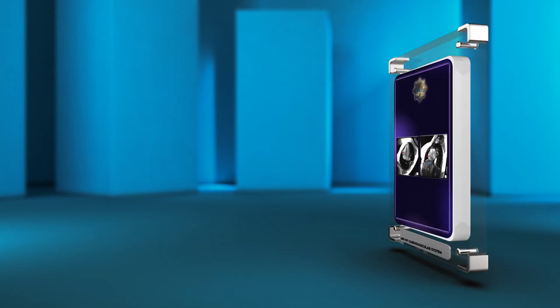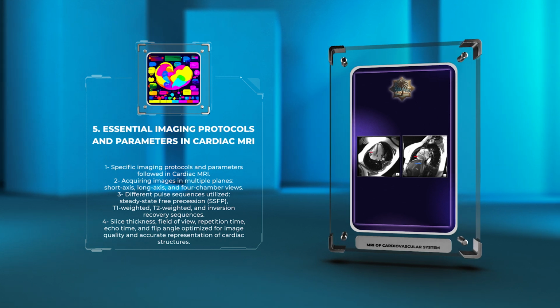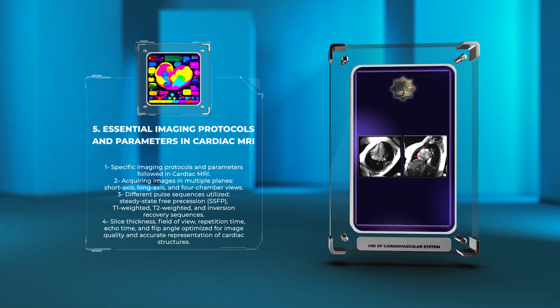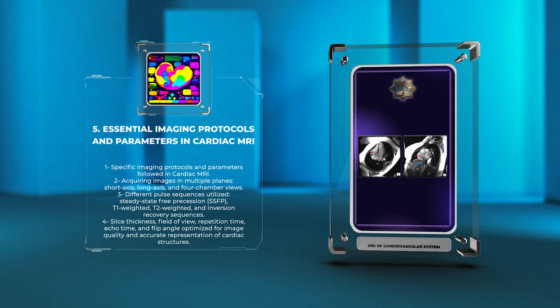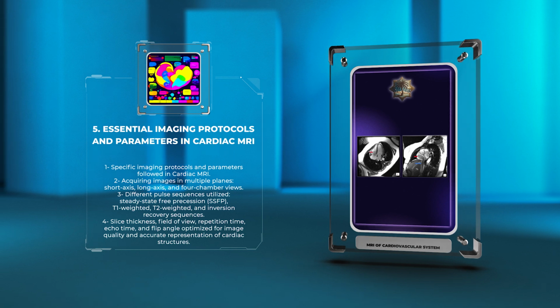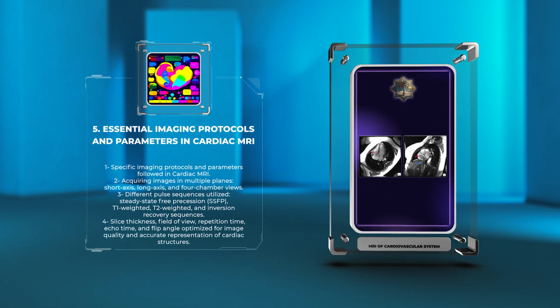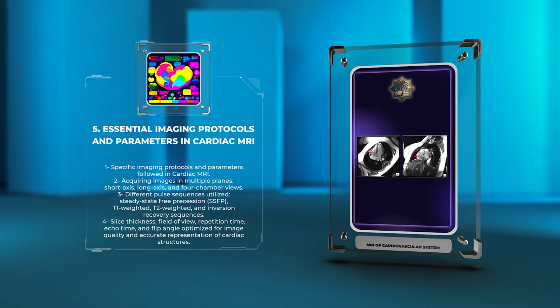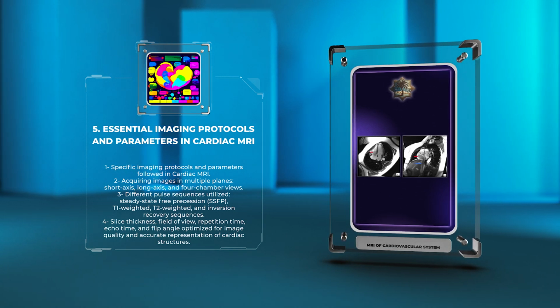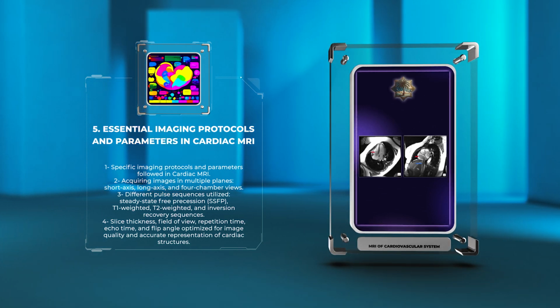To obtain optimal diagnostic images, specific imaging protocols and parameters are followed in cardiac MRI. These include acquiring images in multiple planes, such as short axis, long axis, and 4-chamber views. Different pulse sequences, such as steady-state free precession (SSFP), T1 weighted, T2 weighted, and inversion recovery sequences, are utilized to capture various aspects of cardiac anatomy and pathology. Additionally, parameters such as slice thickness, field of view, repetition time, echo time, and flip angle are optimized to ensure image quality and accurate representation of cardiac structures.